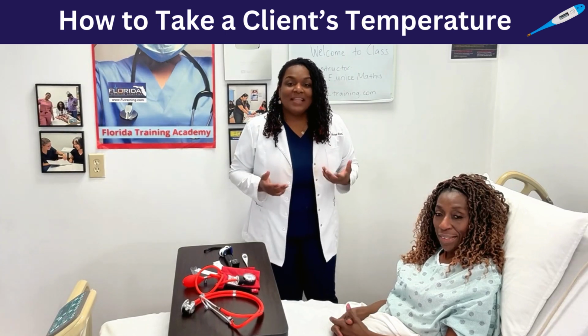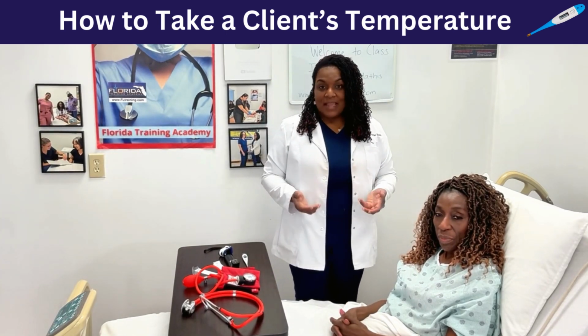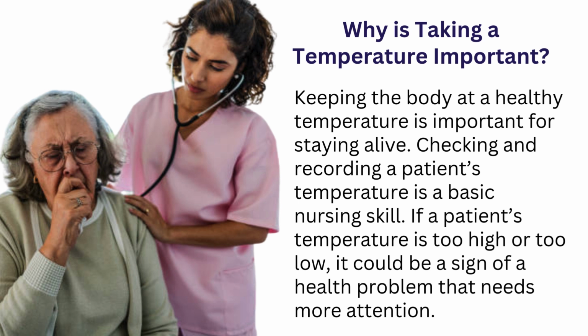So we're going to talk about one of the easiest vital signs there is to actually measure, and that is going to be taking a temperature. As a CNA or patient care tech, it is important to check your patient's temperature, usually at least once per shift or more often if the temperature has been abnormal. Checking and recording a patient's temperature is just a basic nursing skill. If the temperature is too low or too high, it could be a sign of a serious health problem that needs medical attention.